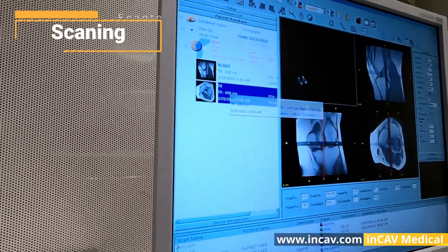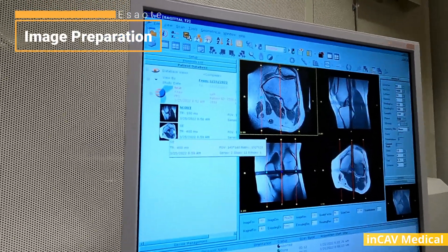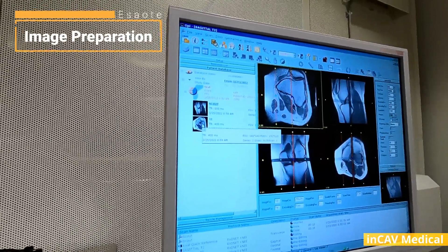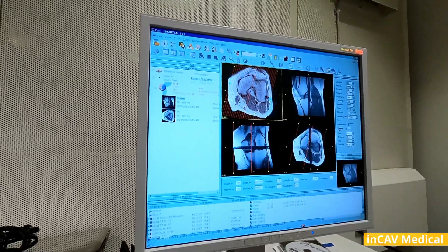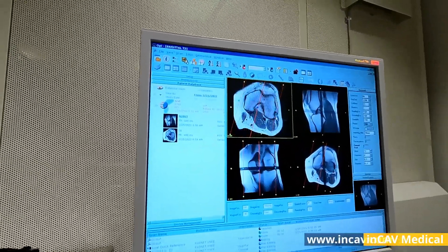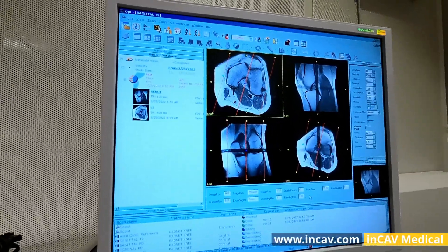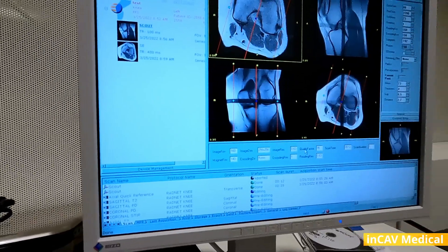The second image is ready. We drag it to the work area. Here we will do the tune-up of the image. We will choose how many slices, thickness of the slice, and angle and more. In this case, we are doing 23 slices. Each slice will be 4 millimeters.